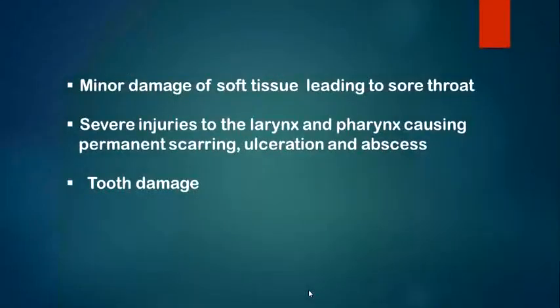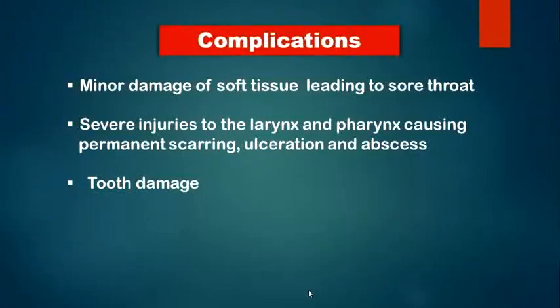Now, these are the complications: minor damage of soft tissue, of course, because of using the direct or the metallic blade. It may lead to tooth damage during introducing it, or severe injury to the larynx causing permanent scarring or even ulceration and abscess.